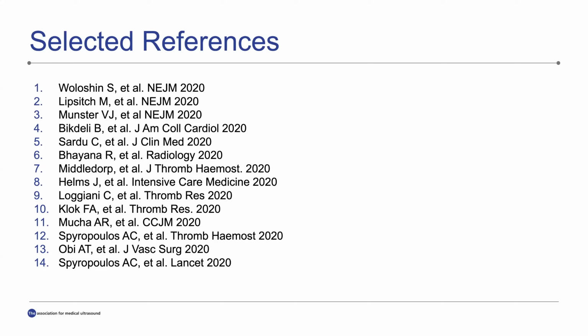They were doing specialized lung ultrasound protocols, and certainly the number of B lines was important, but they would do a standard protocol in these patients to try to cover as much area, looking for evidence of pneumonia, looking for areas of decreased perfusion, and looking for areas of interstitial fluid.